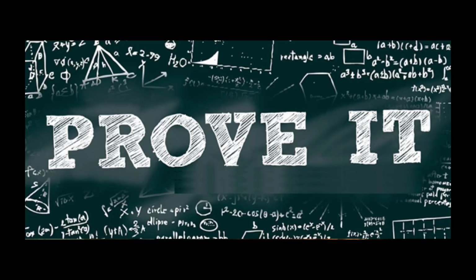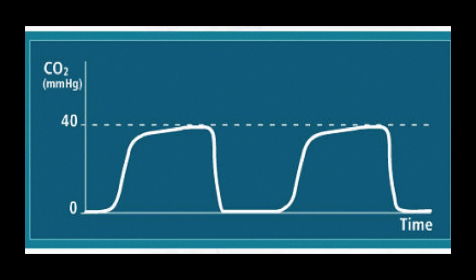The next P is proving tube placement. And we want to re-emphasize that waveform capnography is the gold standard for tube placement, with visualization of a standard end-tidal CO2 waveform. Chest X-ray and auscultation are helpful adjuncts. Both can be misleading. Both can lead to misplaced tubes not being identified. When you see a proper waveform with waveform capnography, you have clearly placed a tube in the glottic structures, and this is what we want you using from a gold standard perspective.